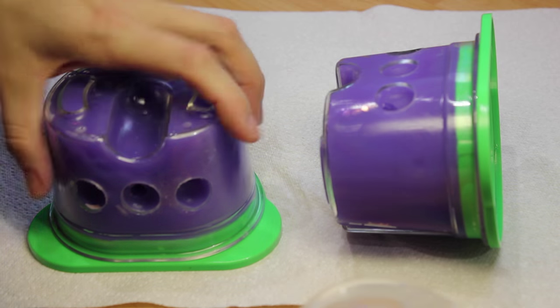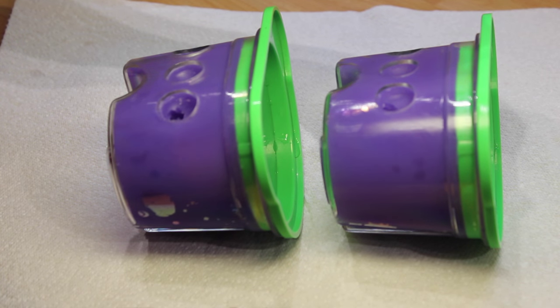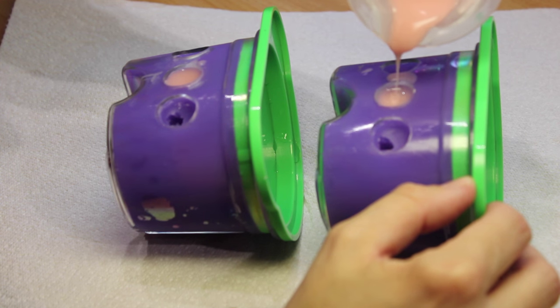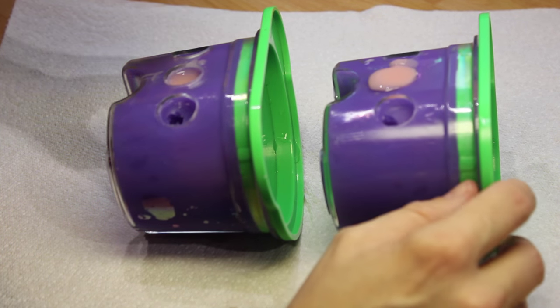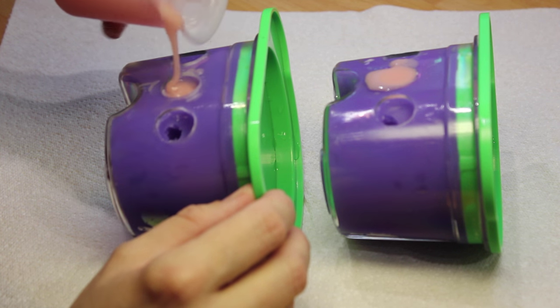Put the flasks on their backs and pour the acrylic in a thin, steady stream into the centre channel. Keep going until you see the acrylic appear in the two air holes. You can see how quickly it starts to lose its pouring quality, so you have to work quite fast.